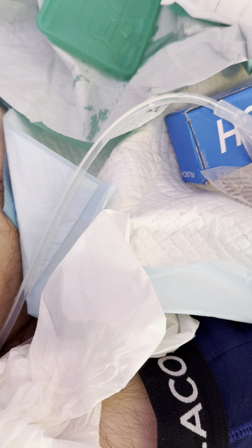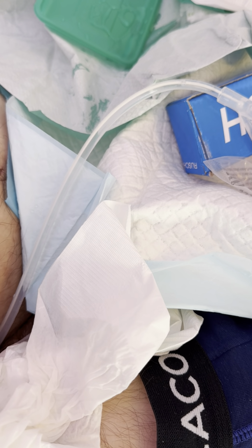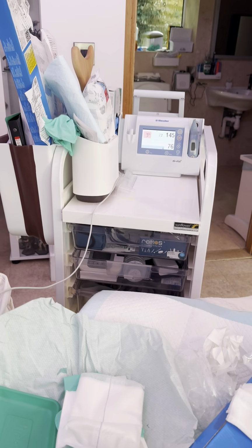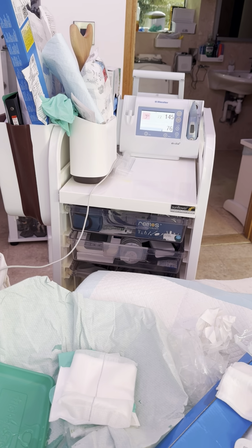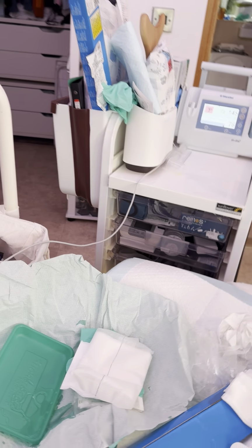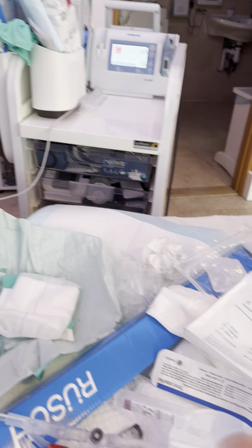I'm so hot. We're boiling in this room because I've got PPE on, for an hour, and I'm laying down on the bed. And look, we've got a beautiful reading there: 145 over 76 and 72. So that is beautiful.